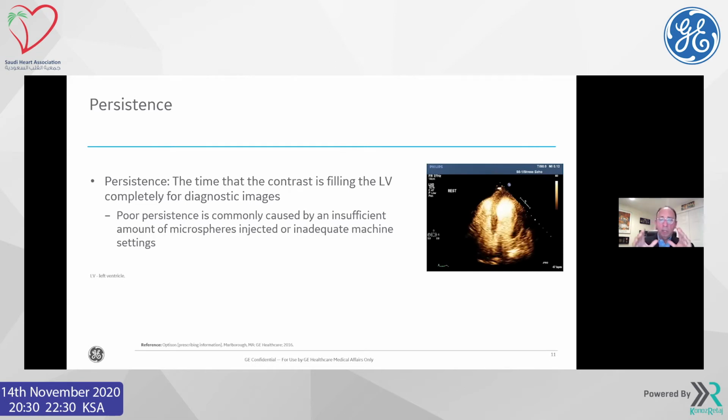The only time you will inject a little quicker, and this is the only time you inject a little quicker, is when you have a low ejection fraction. Because imagine if you have an ejection fraction of 20 to 25%, and it's doing this. A slow administration is not going to get from the right to the left side. So you might have to push it a little faster.